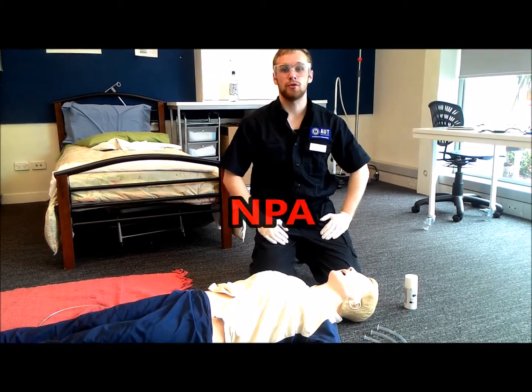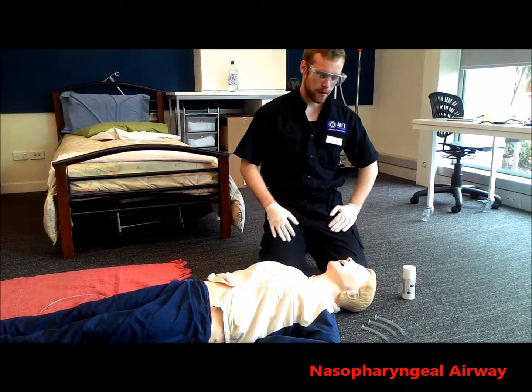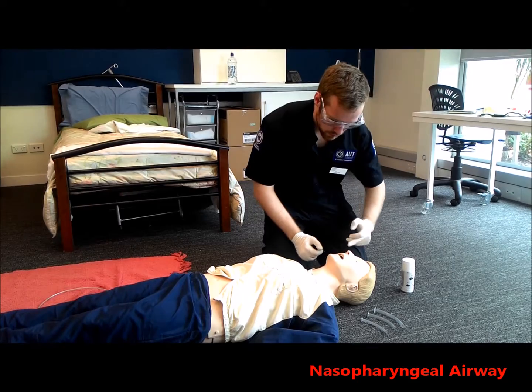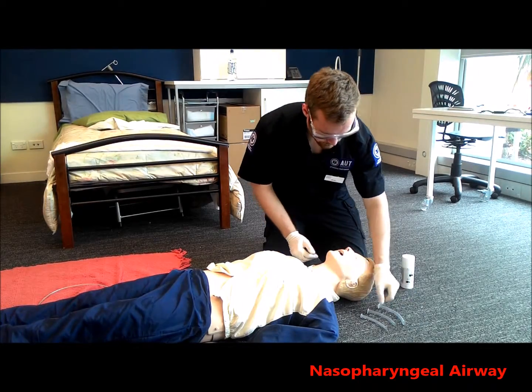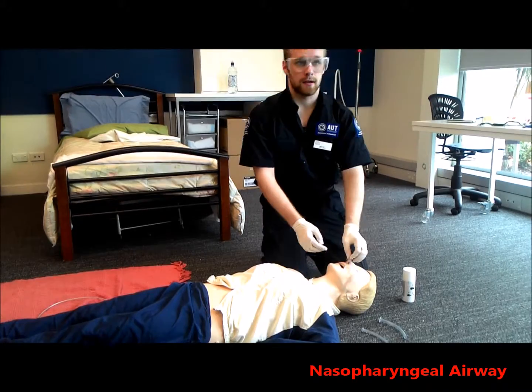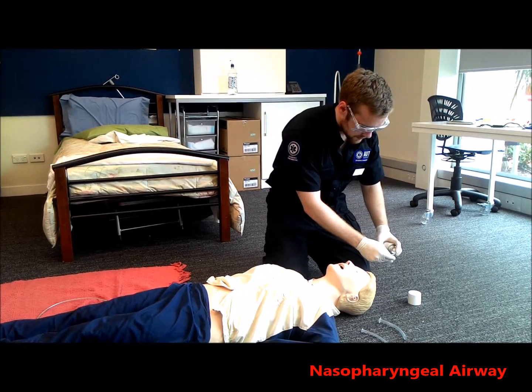So now I'm going to show the proper use and application of an NPA, nasal pharyngeal airway. First of all, you do this by measuring the patient and what size they require. So you go from the largest nostril to the angle of the mandible. So this one here is too long. You go with this one here. That looks perfect. So what you want to do is lubricate it to allow easy access into the nose.